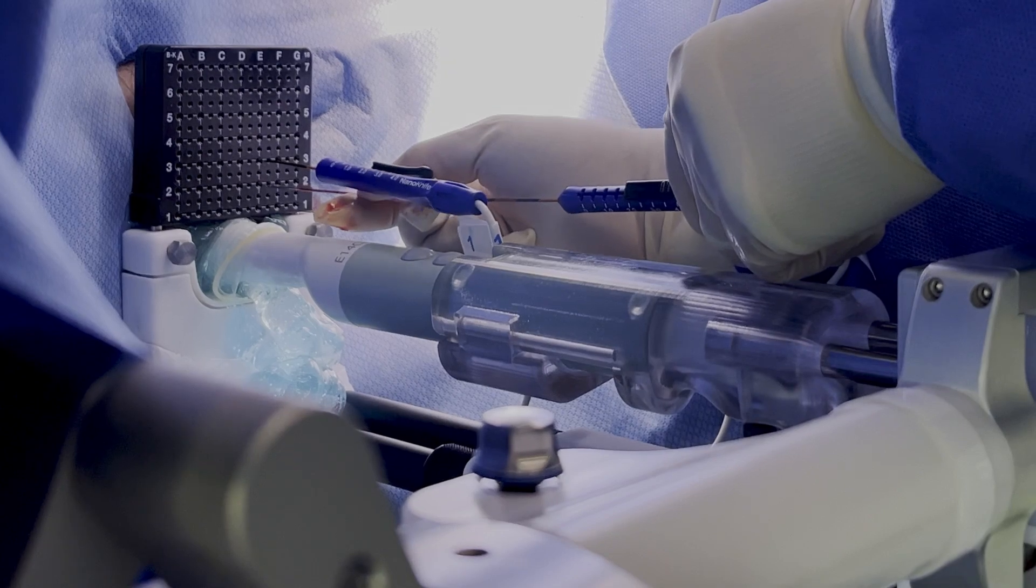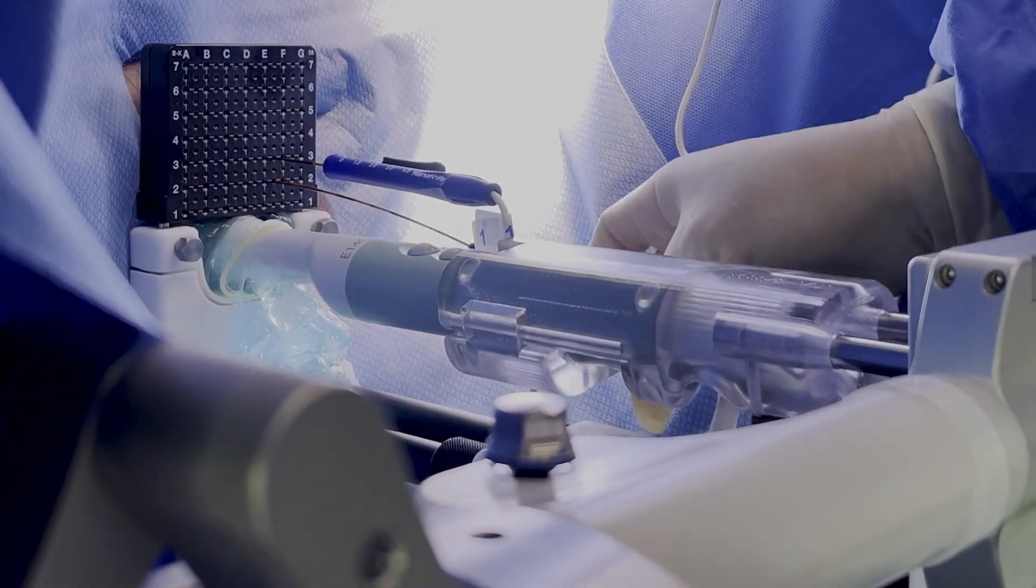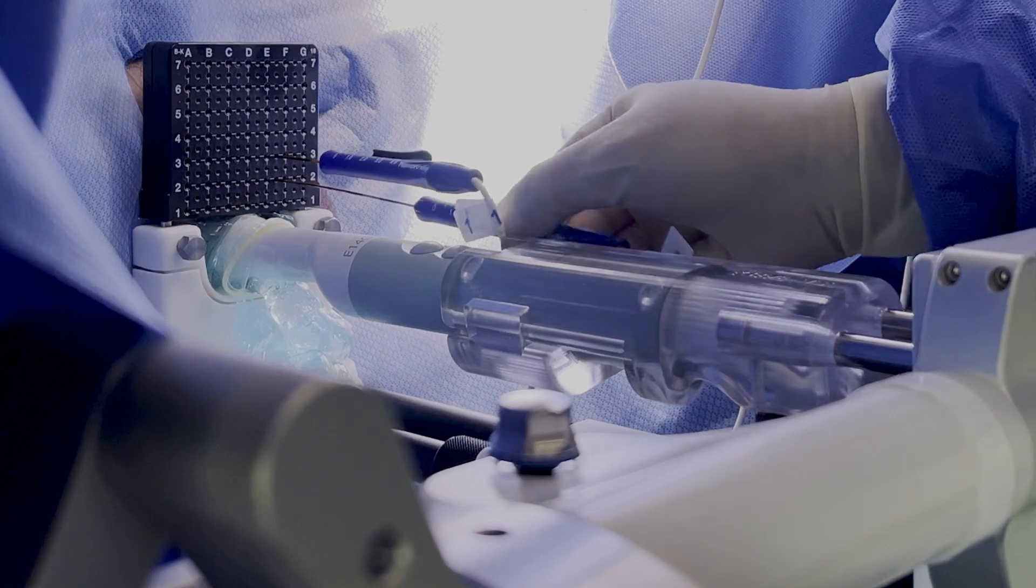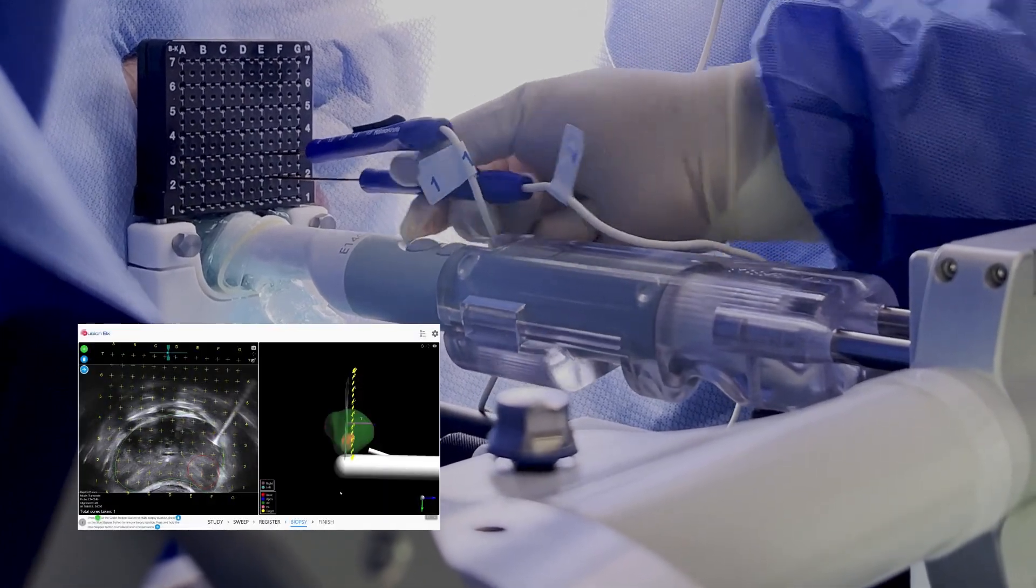The semi-robotic arm stabilizes the probe for hands-free operation, while the 3D model is designed to help urologists accurately and consistently place multiple nano knife electrodes around target lesions.